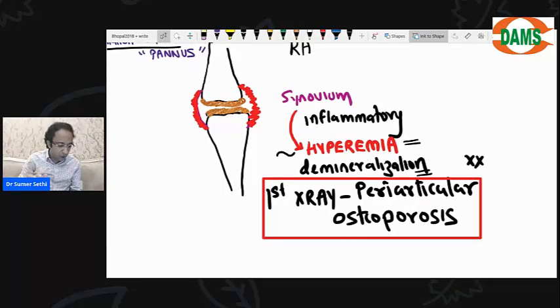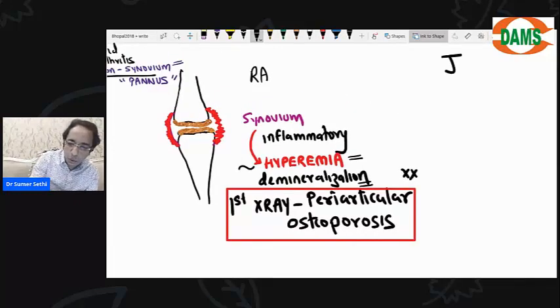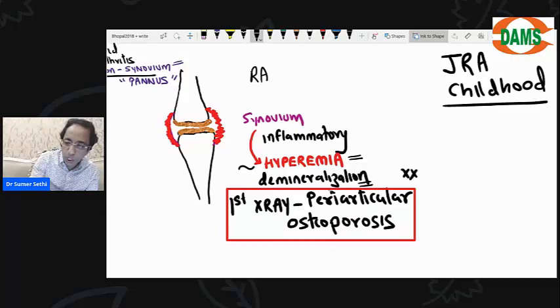Yes. Okay. Now why epiphyseal enlargement is not happening, beta? Please see, beta, now you are not able to understand. If juvenile rheumatoid arthritis occurs in a child, the epiphysis will be growing, beta, a growing epiphysis. And that is why it was getting enlarged. Okay, are you clear with this or not?